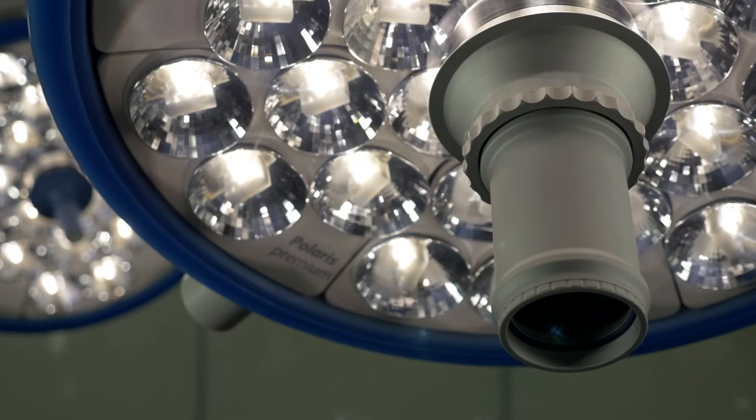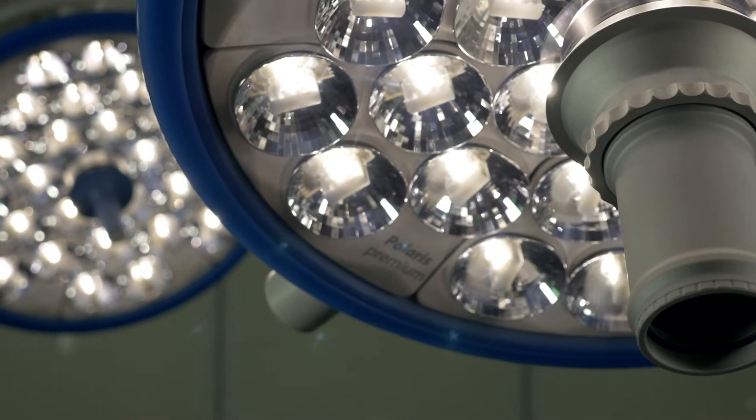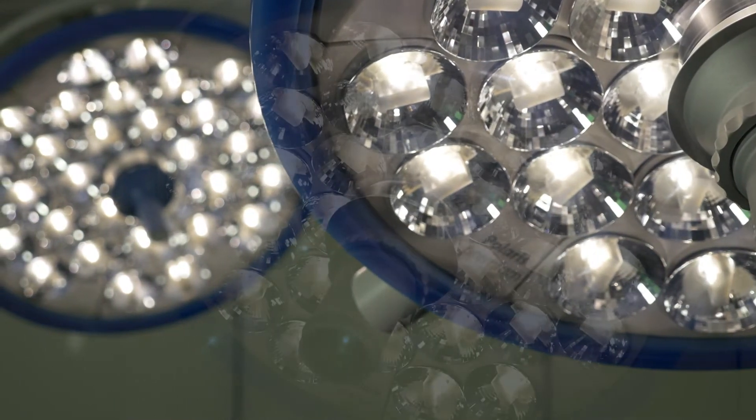Welcome to this Draeger tutorial. Today we present our 500 and 700 series of OR lights from the Polaris line to familiarize you with their functions.